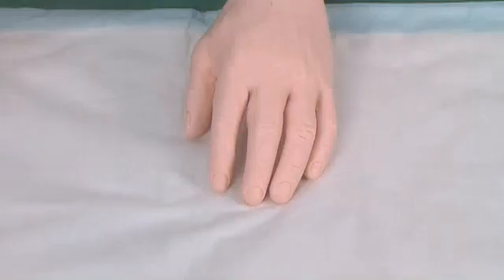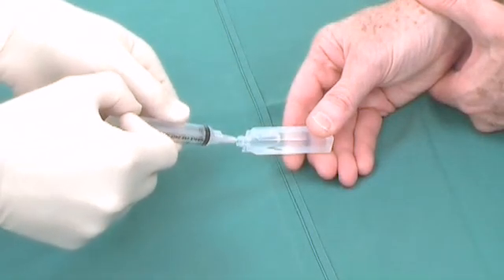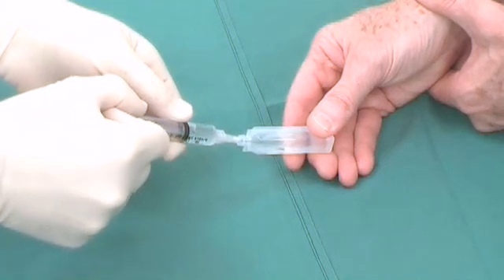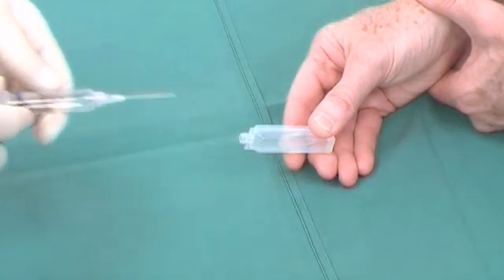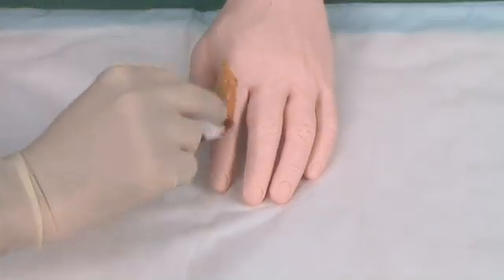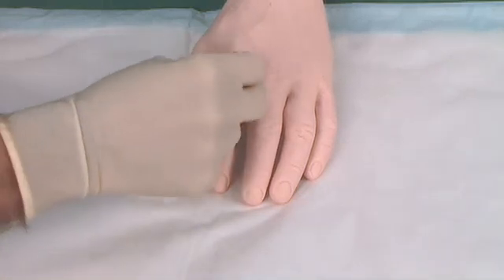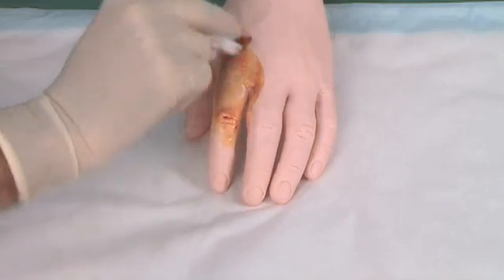Rest the hand over the linen protector in the pronated position. The fingers should be extended. Don the sterile gloves and aspirate the local anesthetic in an aseptic manner.